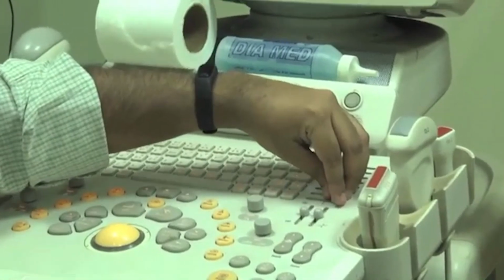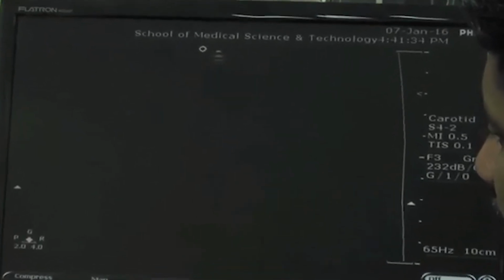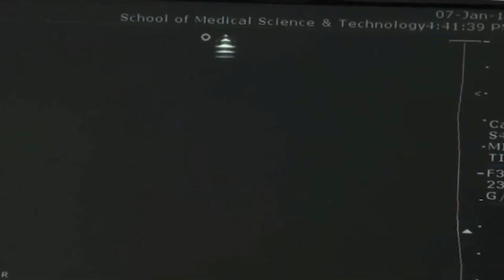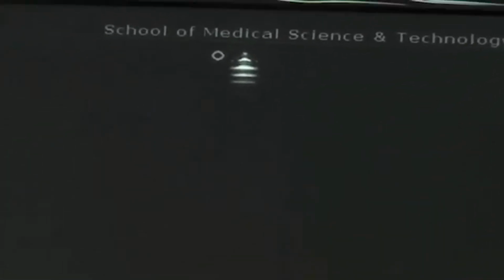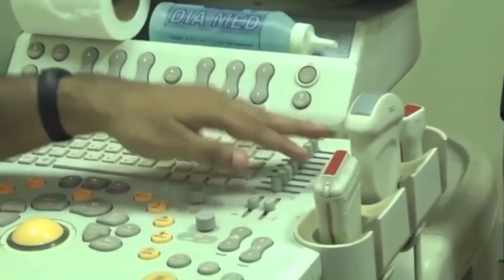So if you look at that screen over there, you can see that as I keep on changing these parameters, there is a gain factor which is changing, shown as a curve over there. Generally we don't make any changes to this, other than the radiologist who has a very subjective jurisdiction over making these changes, because the machine is pre-calibrated and systems are preset as to how to use it.